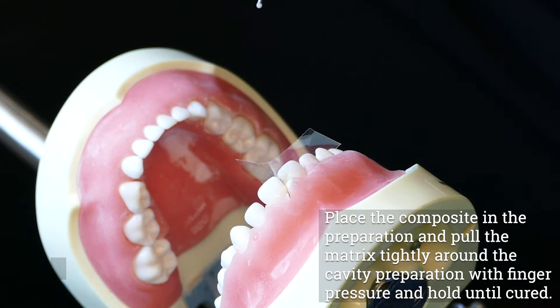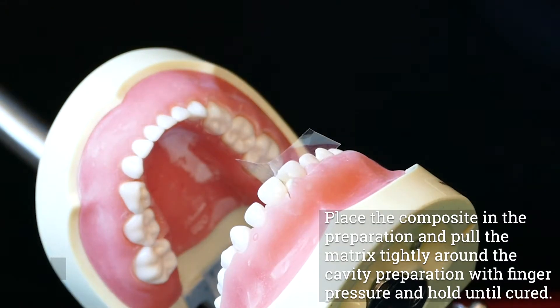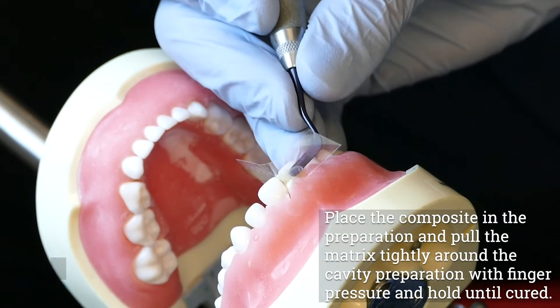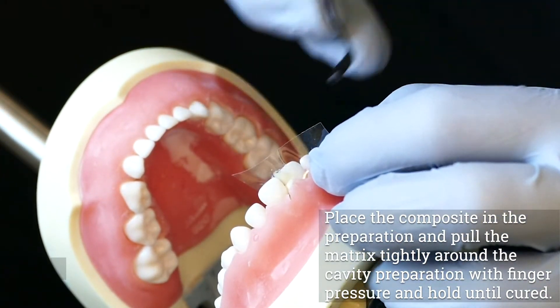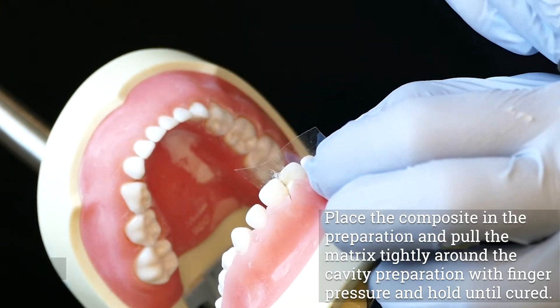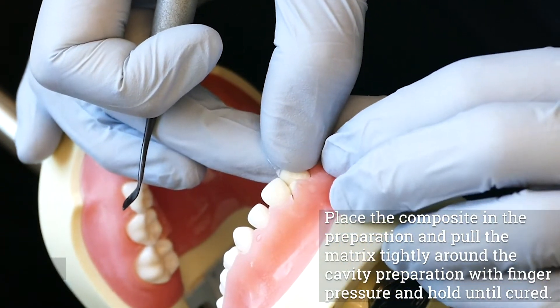Use flowable composite to fill the box portion of the preparation. With a plastic instrument or pressure syringe, place composite in the preparation. Pull the matrix tightly around the cavity preparation with finger pressure and hold until cured. Hold the visible light as closely as possible to the composite and polymerize according to the manufacturer's instructions. The light should be directed from both the facial and lingual surfaces to ensure complete polymerization. Avoid looking directly at the polymerization light when it is turned on.